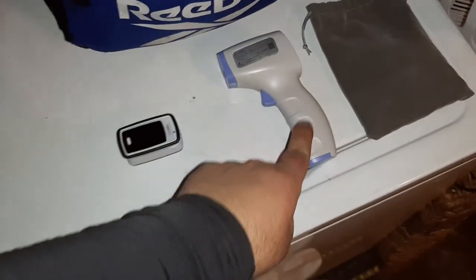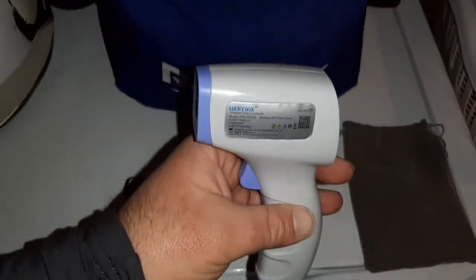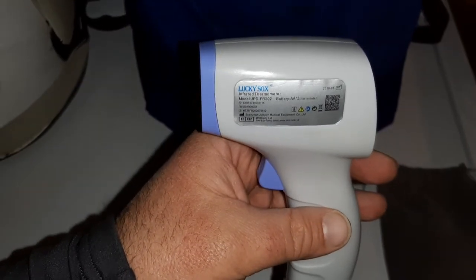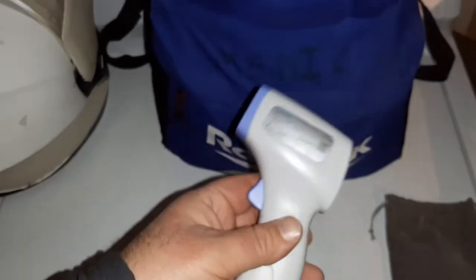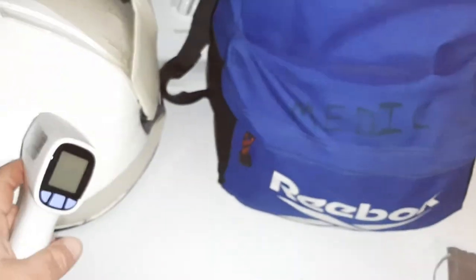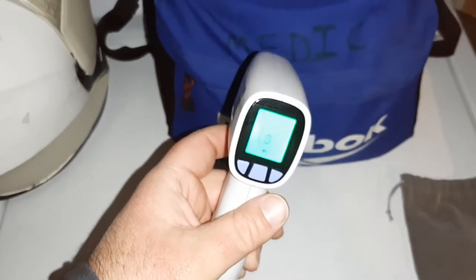Then the temperature gun. I've gone through a few of these — not because I go through them, just because I lose them or somebody takes them. But this one's made by Lucky Socks, model JPD-FR202, as you can see right there. Pretty simple to use. There's two modes: there's a human being mode, and then there's an inanimate object temperature mode. The way it works is you press the button and it'll turn on.